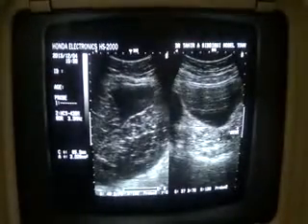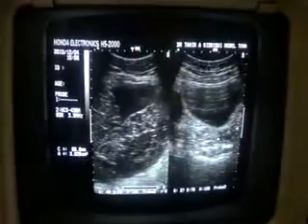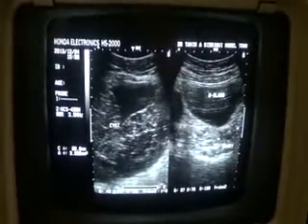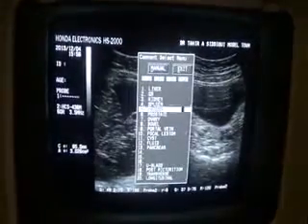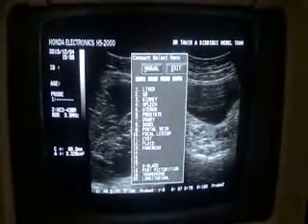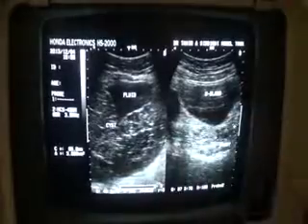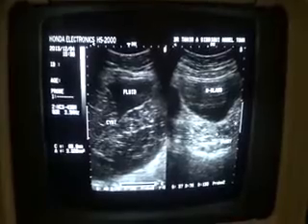The right ovary is not seen, and this ovary does show follicular activity, but the size of the ovary is also small, hypoplastic. We'll measure, just a minute. This is the cyst. And the appearance of this cyst is very much consistent with mucinous cystadenoma, with no calcification. No calcification is seen, no solid element is seen in this cyst. It has a thin wall, and posterior wall acoustic enhancement is seen.